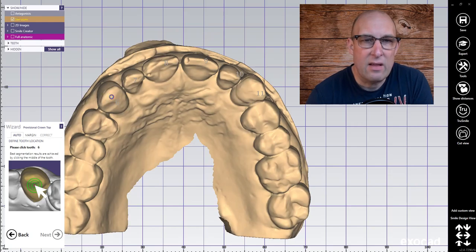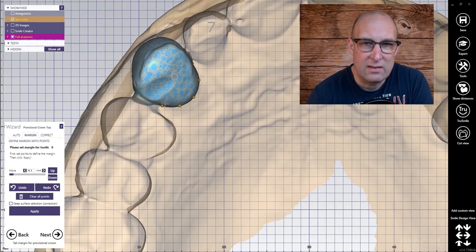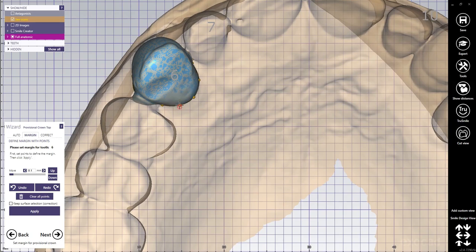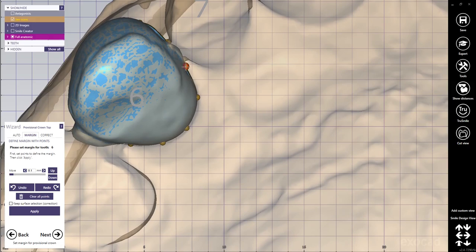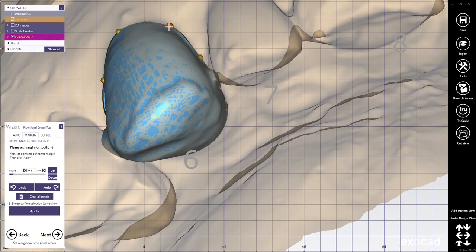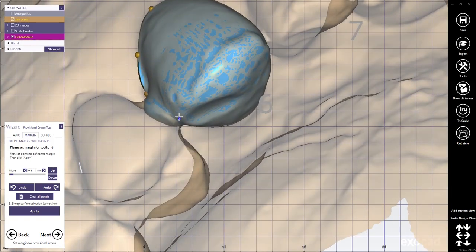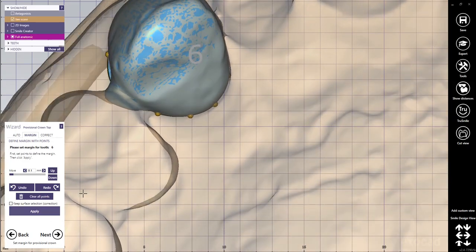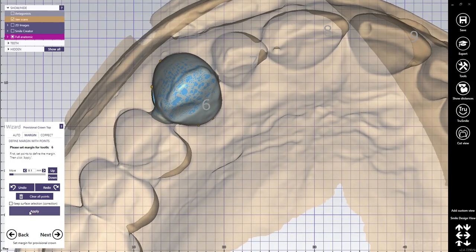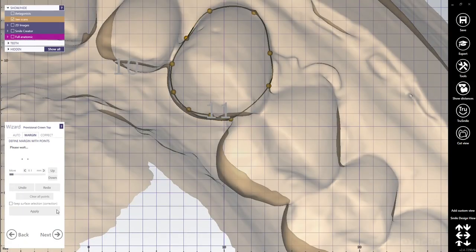Here in the provisional crown top I'm selecting one tooth in the occlusal surface. You see these little balls on the gingival side — I'm bringing them in a little bit so the distortion is getting eliminated. Don't bring them in too much, otherwise the crown gets too small and you get parts missing. Click apply. I'm going to do this for every other tooth, from 6 to 11.